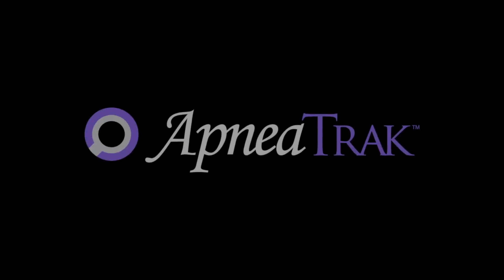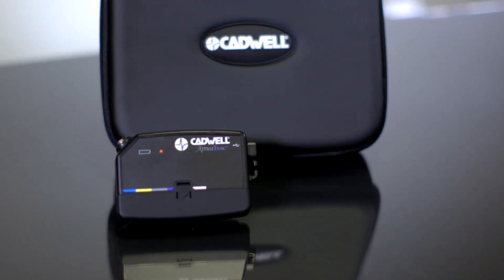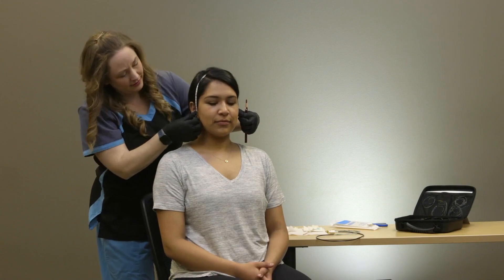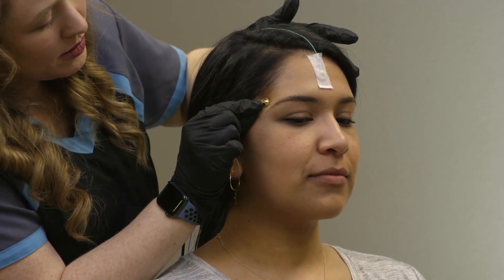Your healthcare provider has determined that you will participate in a home sleep apnea test. The Cadwell Apnea Track will collect data on your breathing and snoring while you sleep. A qualified sleep technologist should have already attached the electrodes to your scalp in the correct locations.